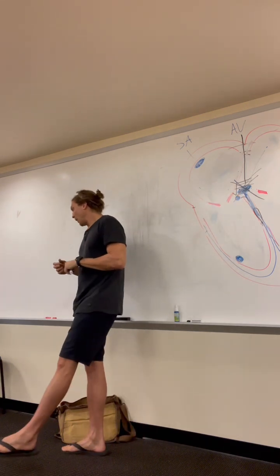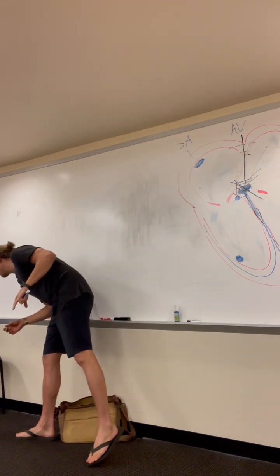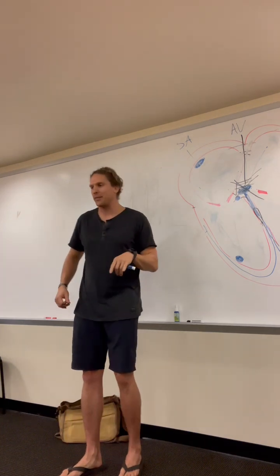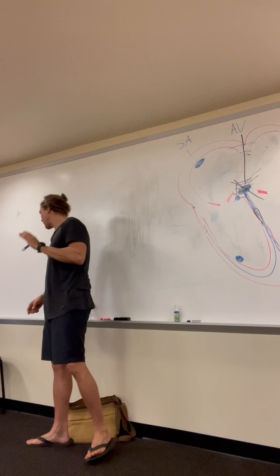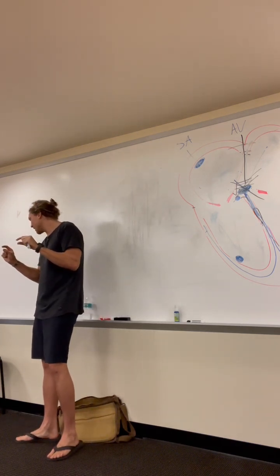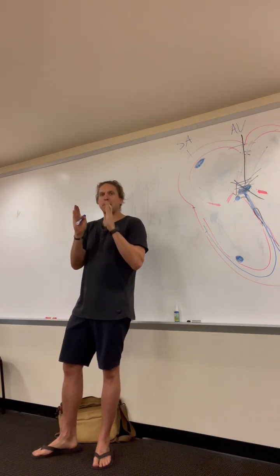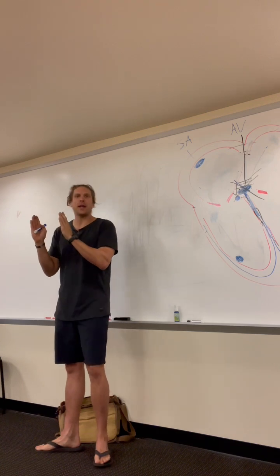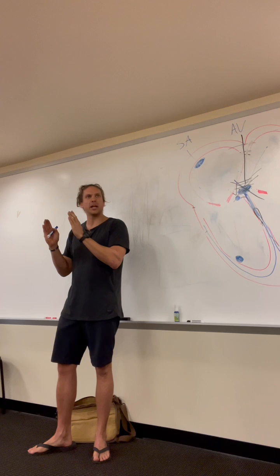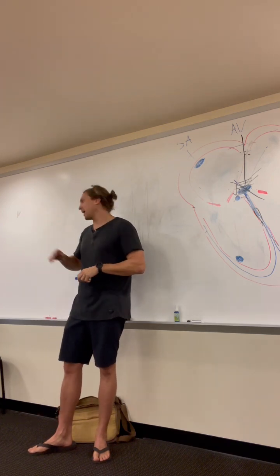So what you can do is find 2 P waves. Look on slide 14, 3rd degree AV block. Find 2 P waves that you know are P waves. So I'm gonna choose those 2 that are between the first R waves. RR, there's 2 P's in there, 2 P waves. I would take a piece of paper and I would draw that distance on that piece of paper. And then I would slide that piece of paper over and I would find that next P wave, and it should line up in a 3rd degree heart block. Slide it over again, and then those P waves will keep lining up.